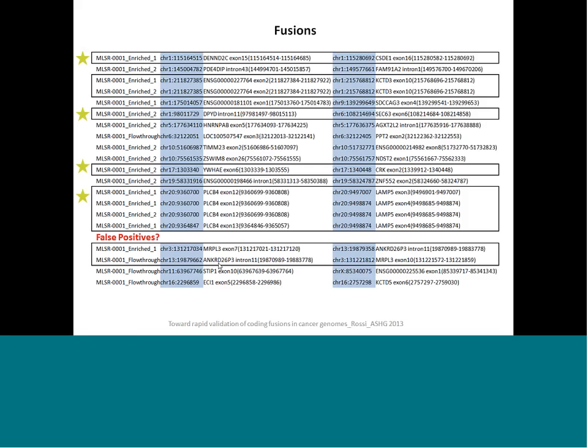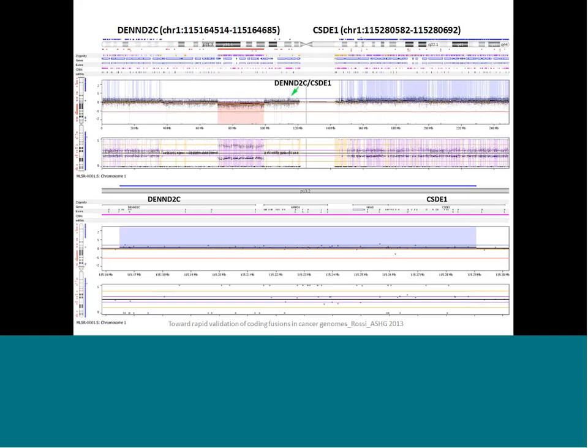And you can see that there are a number of false positives and a number of changes that are from pseudogene to pseudogene, so they're the wrong call at the sequencing level. There's homology between one gene and another partner, so they're difficult to characterize. And we use copy number to try to tie this together, and you could use exome sequencing as well. We find copy number is a little lower cost and a little bit more useful.